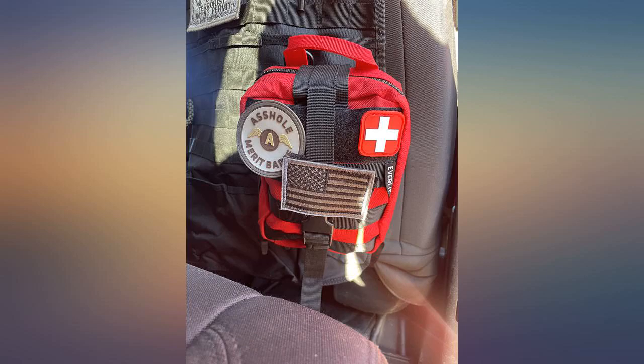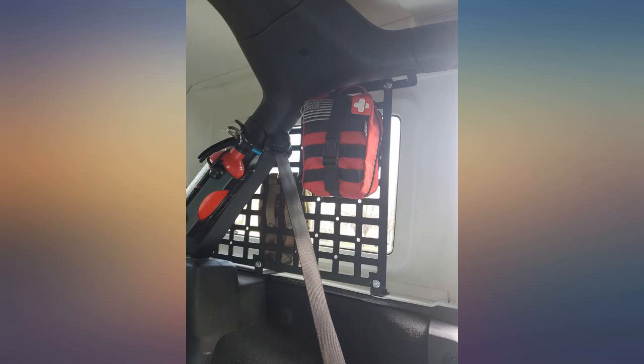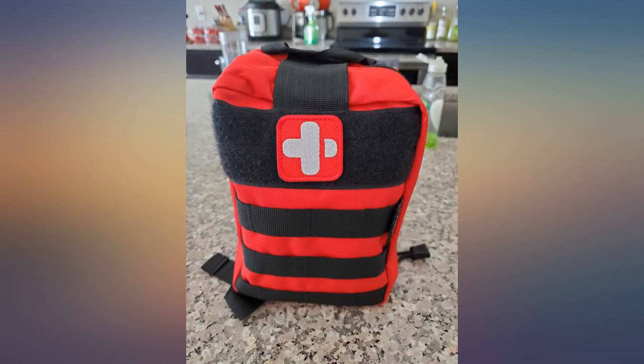Might save my or others' life one day. I'd definitely buy this again. I was pleasantly surprised by the overall quality of the bag itself, and I'm always happy to support veteran-owned businesses.